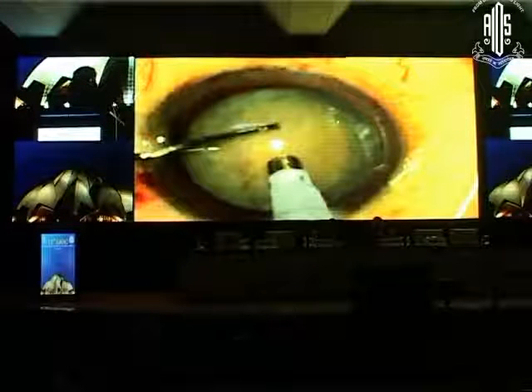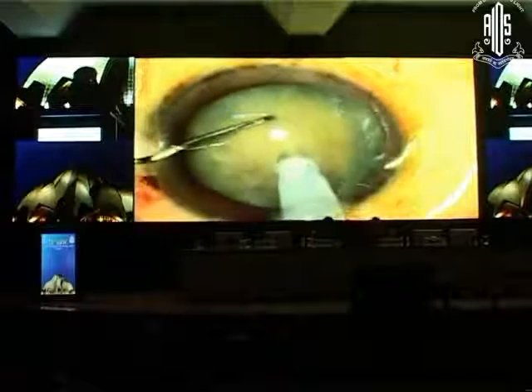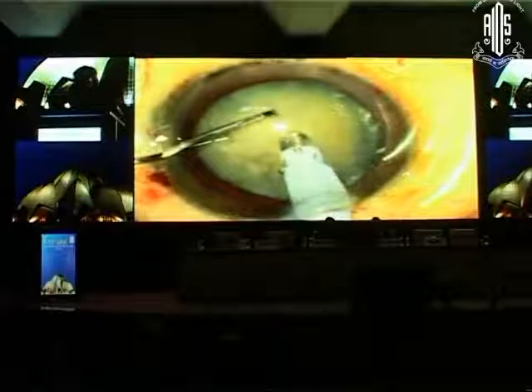So, do I have time to show one more video? Yeah, you can show. So we'll be seeing one more video over here of the direct chop technique, because we already know the trench that we've already been doing.